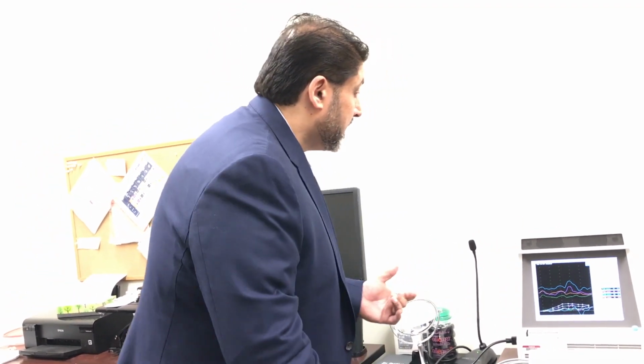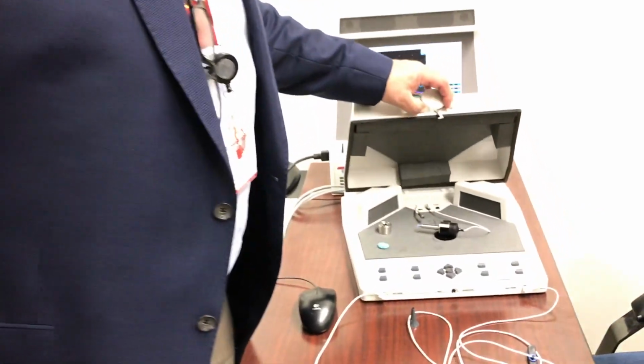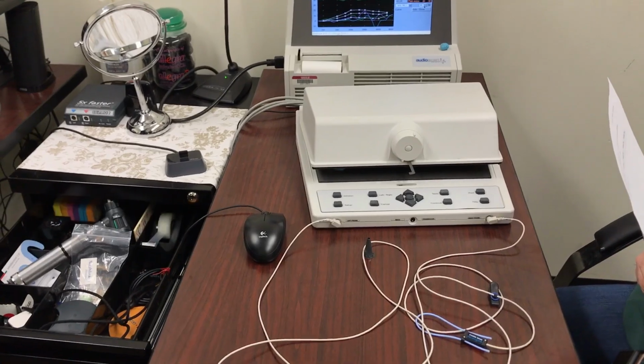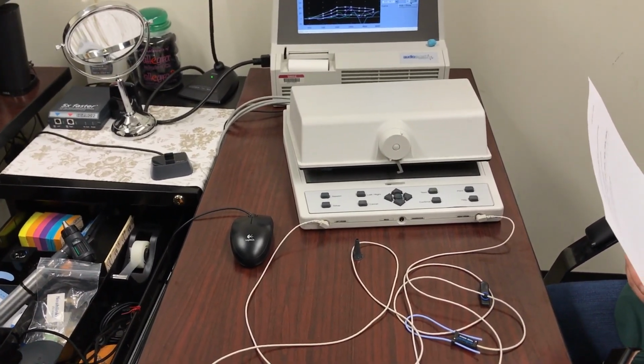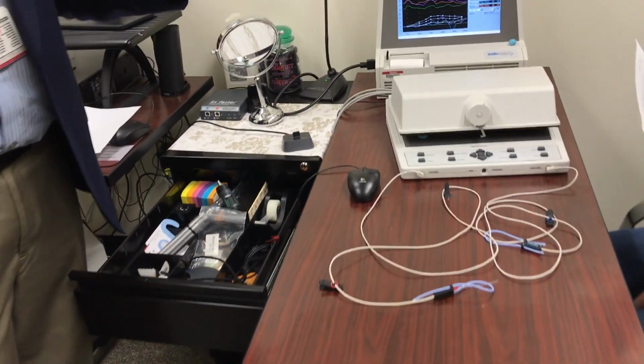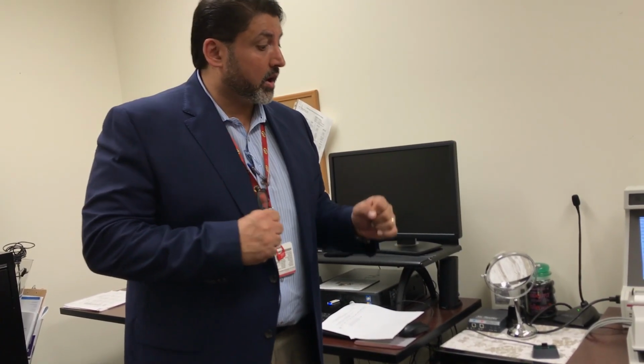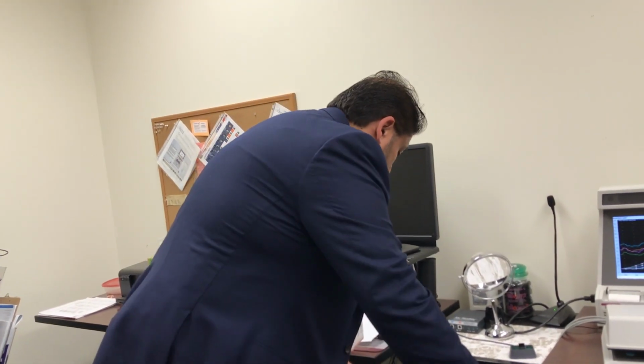Okay? The last thing that you have to do is actually a 2cc coupler piece. And what we're going to do here is a little bit more complicated. What we're doing now is correcting for the difference between the 2cc coupler that the manufacturer has and the person's ear canal. When you go into the fitting software, you will now enter this data, and it will either increase the gain or decrease the gain, depending on what it is that you're trying to do.